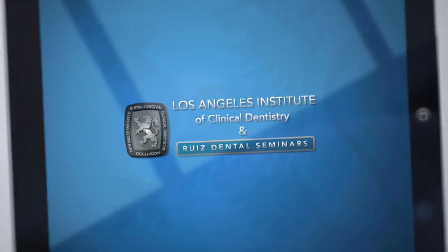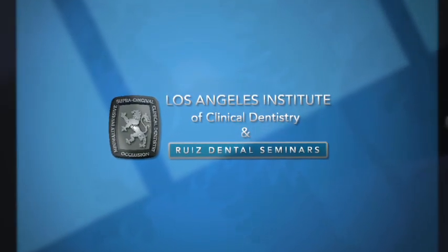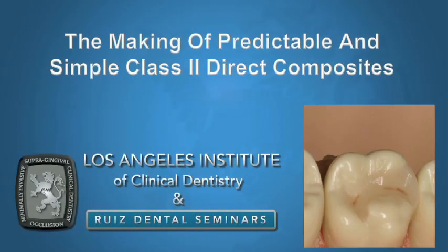My name is Dr. Ruiz, and in this video we're going to talk about the making of predictable, simple Class 2 and Class 3 direct composites. This is something that you're going to encounter on a daily basis. So the making of predictable and simple Class 2 direct composites is really bread and butter dentistry.